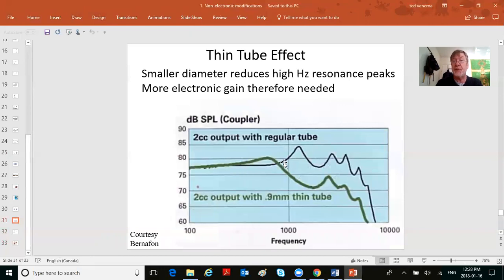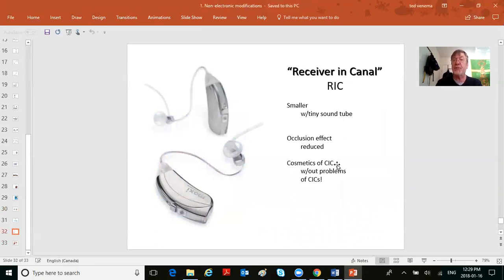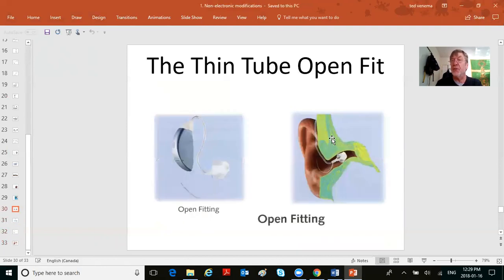So here's what happens with really thin tubes. Here's a thin tube hearing aid. It doesn't have a wire going through it. Okay, it ends in a dome again. There's two types of mini hearing aids used today for most mild to moderate losses. One's called the open fit thin tube, and the other one's called receiver in canal. And the difference between these two is the thin tube has no wire going through it. The receiver and mic are here, and sound is going through the tube. Whereas in receiver in canal, the mic is here, and the receiver is here. So what's in the tube? A wire. RIC hearing aids generally are more expensive than open-fit thin tube hearing aids.